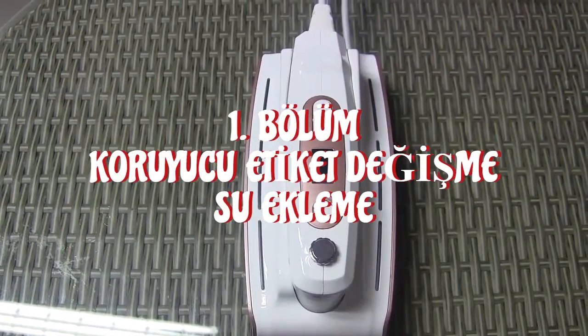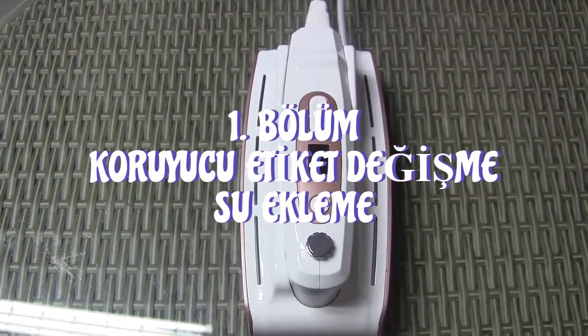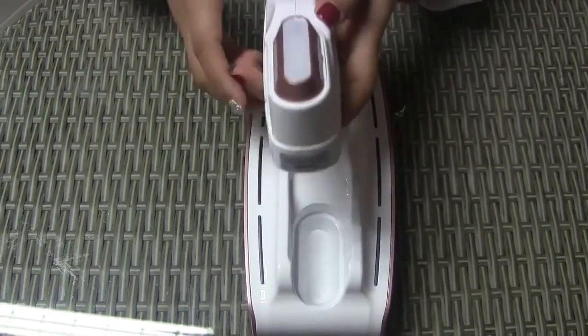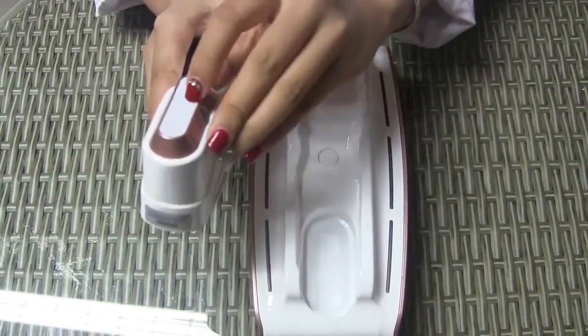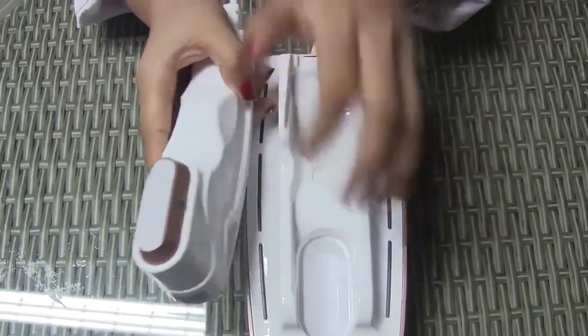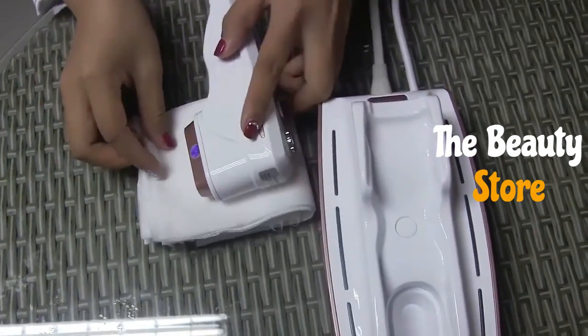Okay, now let's see how to do the water injection and how to change the membrane. And you can see in this situation, that means the water is not enough and we need to inject some water. Firstly, you need to tear off this.